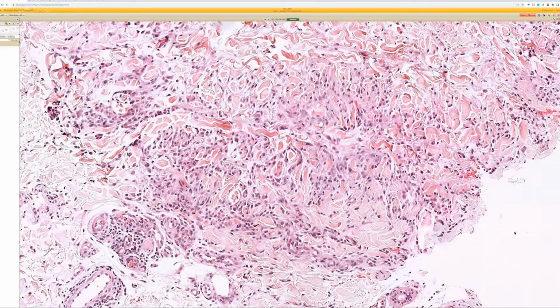Another example would be granuloma faciale, which has a mixture of all sorts of inflammatory cells that fill the dermis: lymphocytes, histiocytes, plasma cells, neutrophils, eosinophils, but really no granuloma formation whatsoever. Just the granulomas in the name only. And there are other examples we won't go into. So just be aware of that.